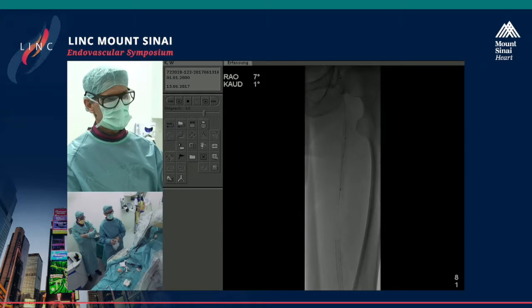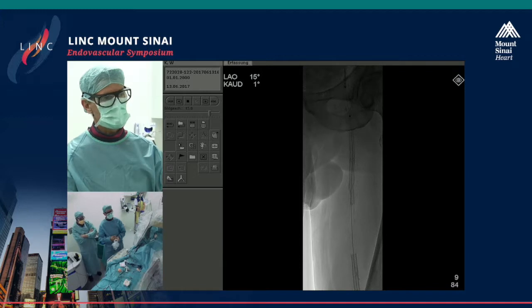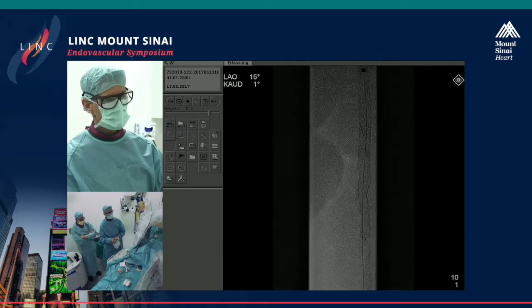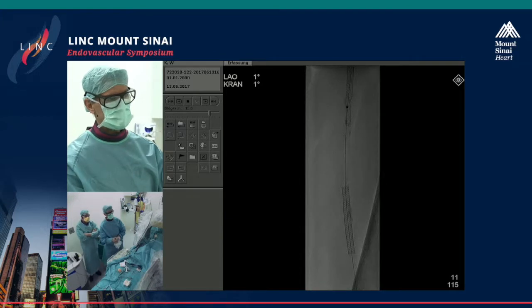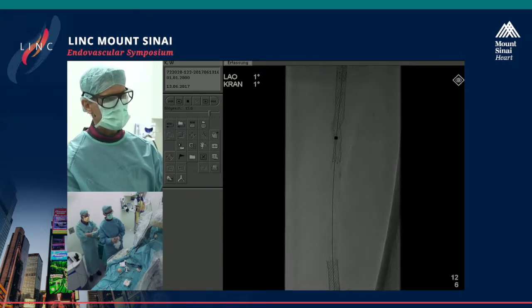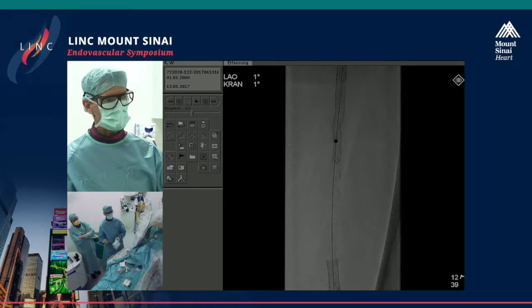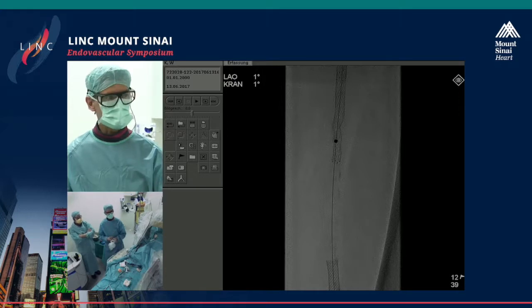Then we started lasering — this is a 2.3mm laser to go through. You can see the stent is not everywhere fully open. This can clearly be discussed: which device would now be the best to clean that stent? I feel quite happy here with having the laser, especially where it is very close to the stent struts. I would not feel comfortable using a TurboHawk, which is not approved for in-stent treatment, because of the fear that it might hook into the stent.